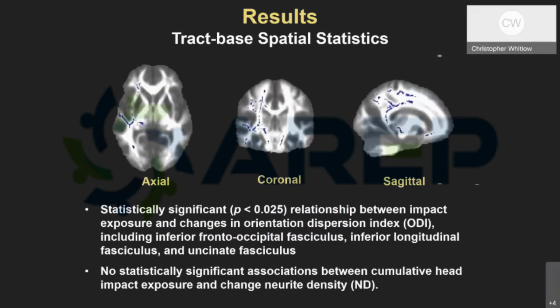And we found some statistically significant linear relationships between the cumulative head impact exposure and the orientation dispersion index.